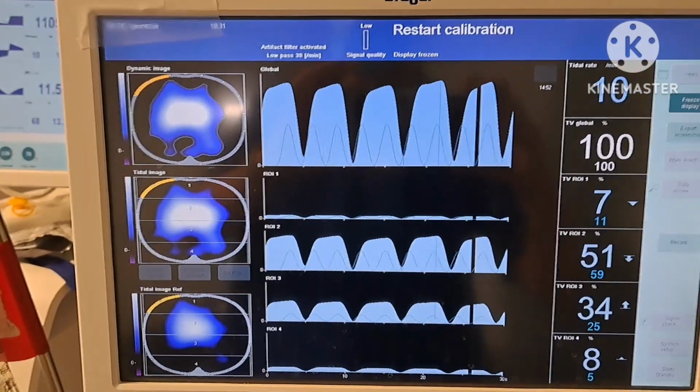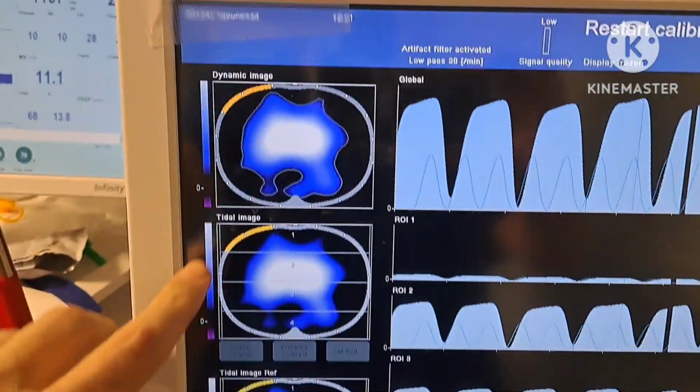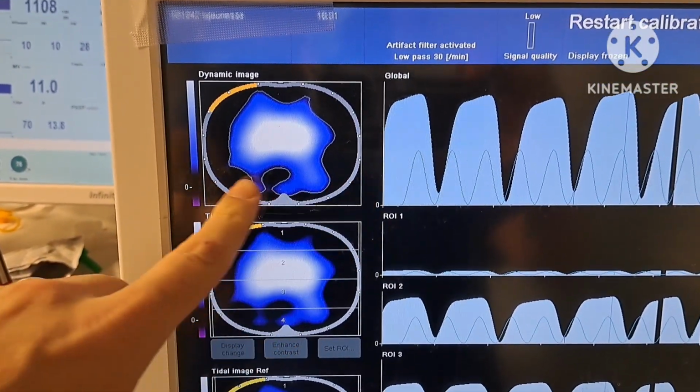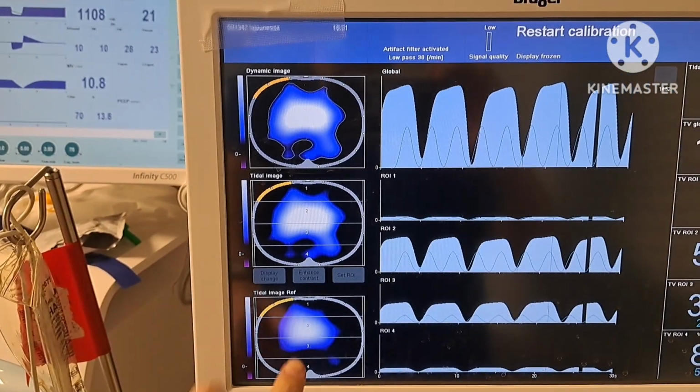Okay, it's maybe another hour about freeze framing. So yeah, very, very good result. We really started to see improvements over here compared to what we started out with.